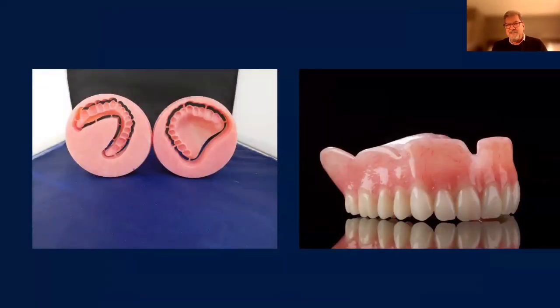This is my first digital denture, and I utilized the Diamond D material from Keystone. It's made in a puck, and I milled it, and I just bonded Vita denture teeth into the denture base. It came out pretty nice. So I still think that the milled denture bases look a little bit better than the printed denture bases. So very nice denture. I'm excited about digital technology, but I'm also excited about the analog portion of it.